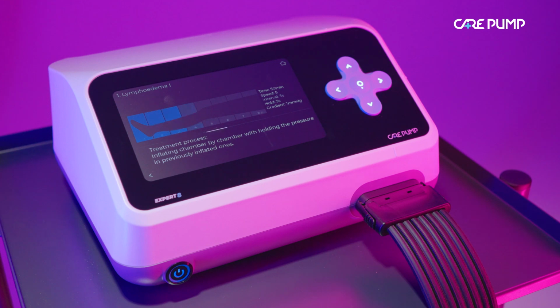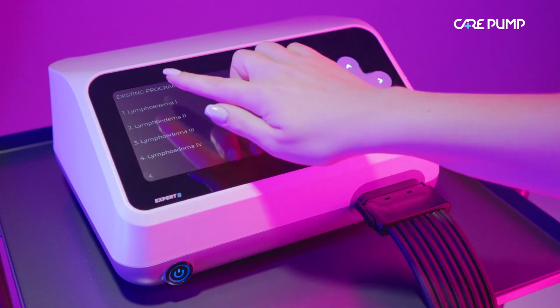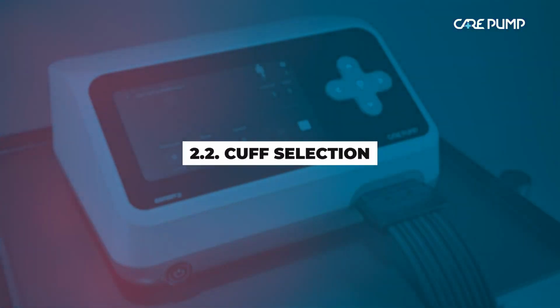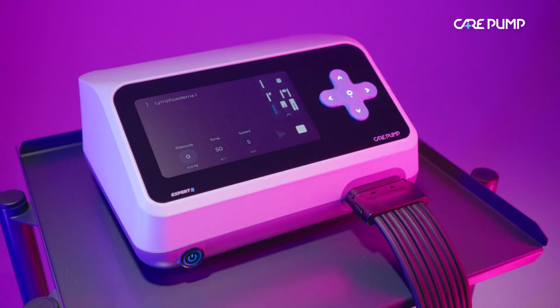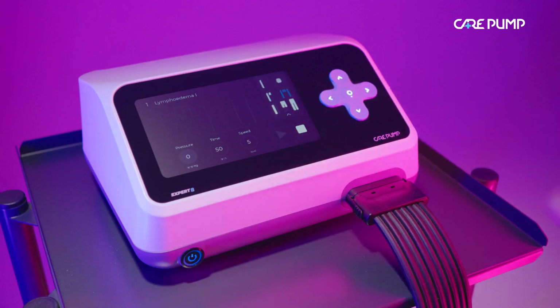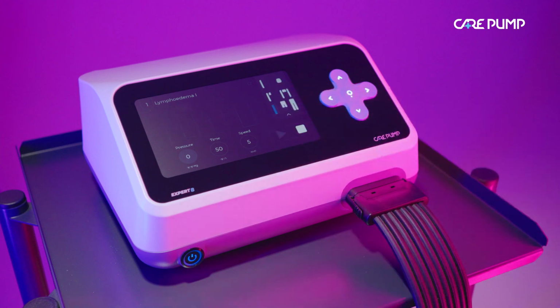Pressure is not defined for the programs, and its value should be adjusted each time to the patient's condition and needs. Cuff selection. You can monitor the course of the treatment on the cuff visualization shown on the screen. To select the correct cuff, touch the human body icon and select the appropriate body part. The screen will display the selected cuff divided into numbered chambers.